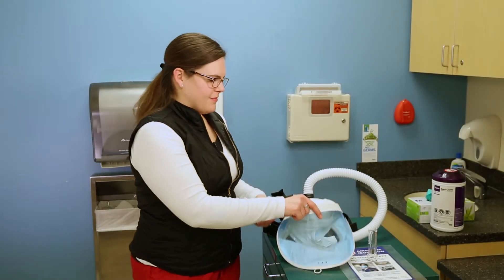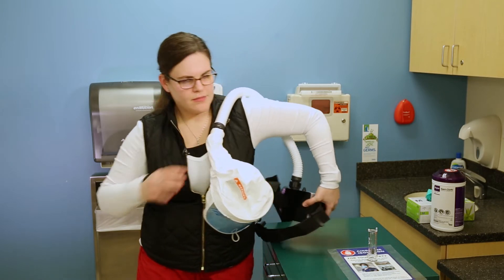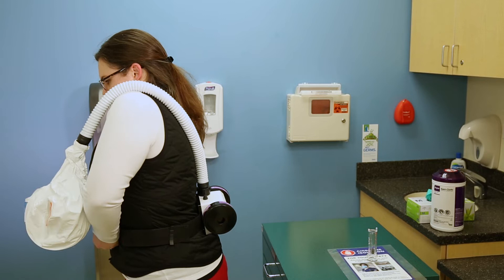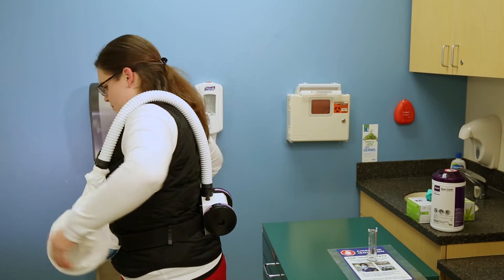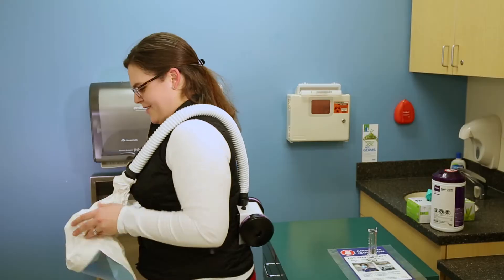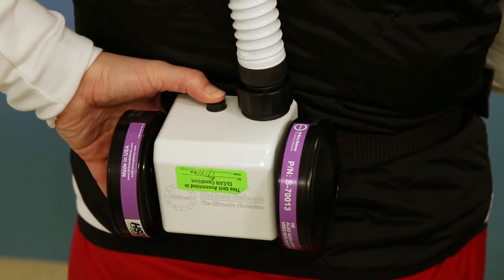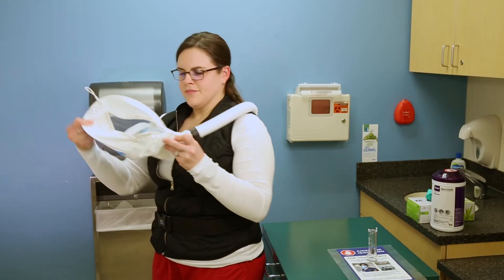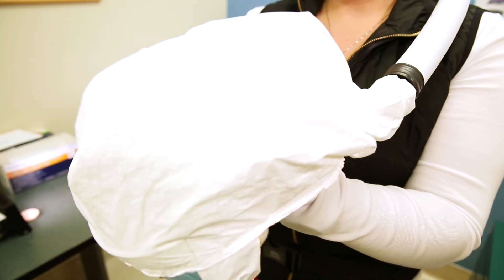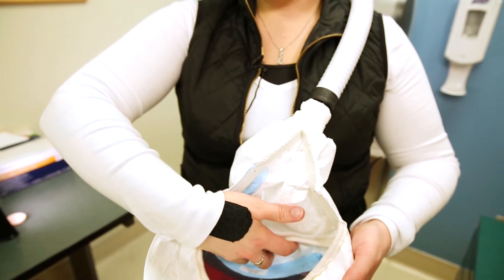When putting your PAPR on, first you'll take your hose and put it over your shoulder — this way your hood never touches the ground. Next, take your PAPR and place the belt around your waist, snap it shut, and tuck the straps in so that they sit close to your body. Next, you'll turn the machine on. Once the machine's on, always make sure that your hood is not twisted and you're getting the full adequate airflow. You will feel the airflow coming from the inside of the machine.